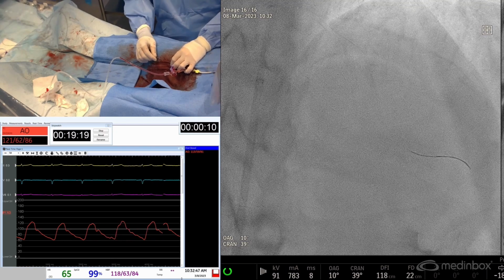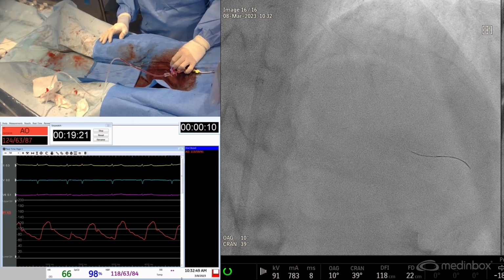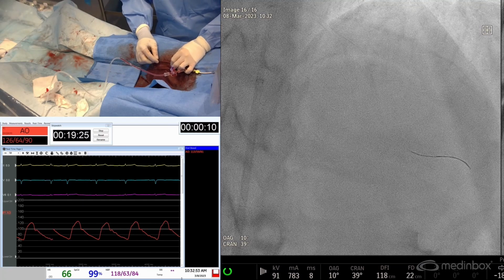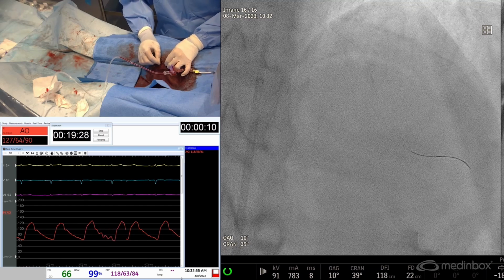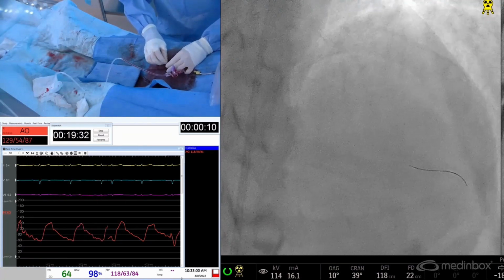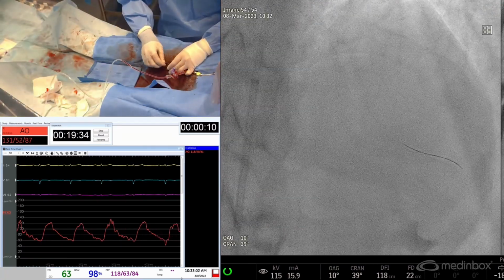And basically the RPM can drop more if we start at a higher rate. So this is a two-man operation that we're doing. But as you know, you can also do a one-man rota.